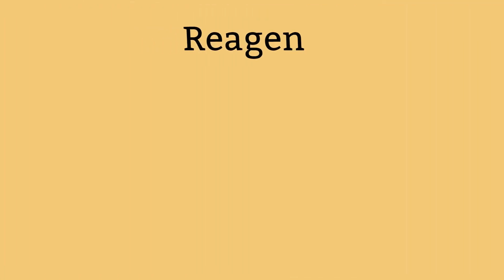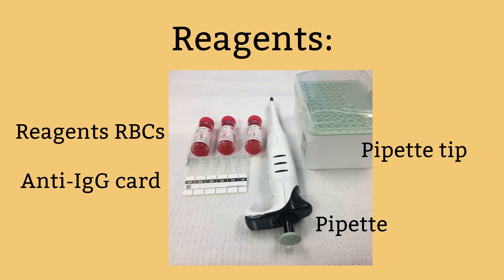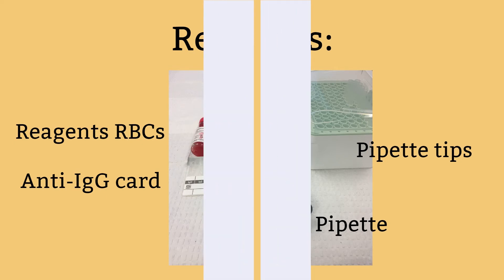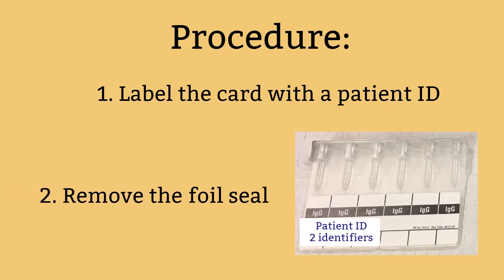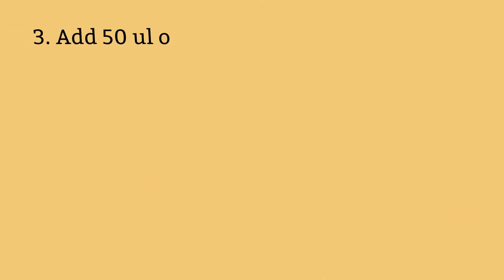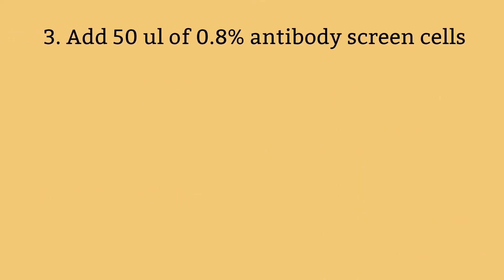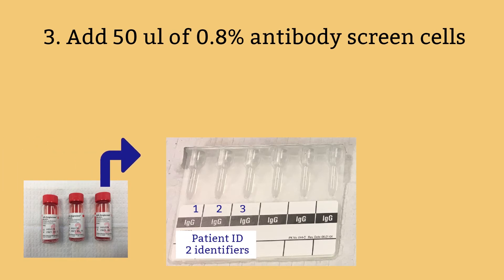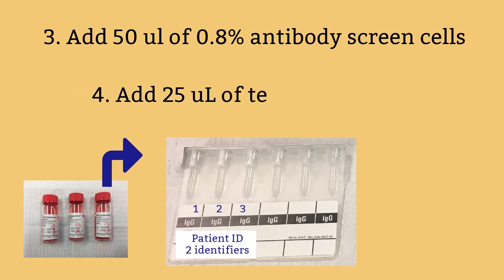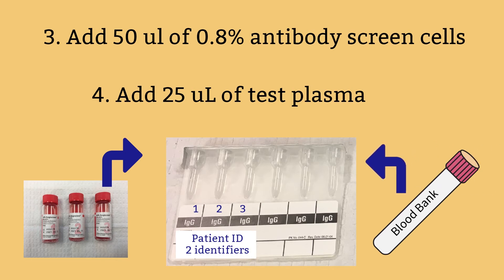For the gel method, we will need an anti-IgG card and antibody screen cells at 0.8%. Step 1: Label the card with patient ID — remember to always use two patient identifiers. Step 2: Remove the foil seal from the microtubes to be used. Each card has six microtubes; we will be using three screening cells, so only remove the foil for those three microtubes. Step 3: Add 50 microliters of 0.8% antibody screen cell suspension to the labeled microtube. Be careful not to let the tip of your pipette touch the gel card or the liquid inside. Remember to change the pipette tip for each screening cell.